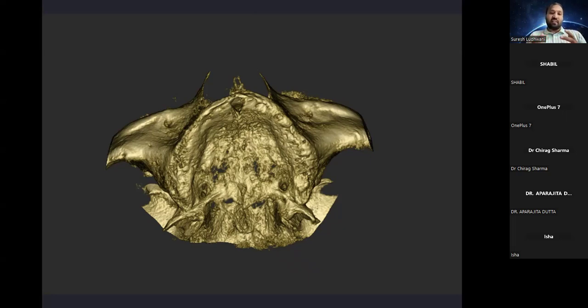With this, at least we can prepare a model for you which has the soft tissue layering above the bone also. So when we give it to you, it has the model with the bone and the soft tissue. But that is not compulsory, because angulation won't change with it. It is only about how close you want to go to the clinical scenario. Otherwise, planning doesn't require the soft tissue, because everything you can get from the CBCT. Now let's understand this CBCT in this video.